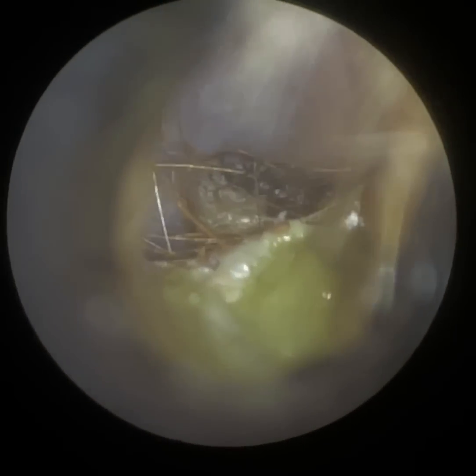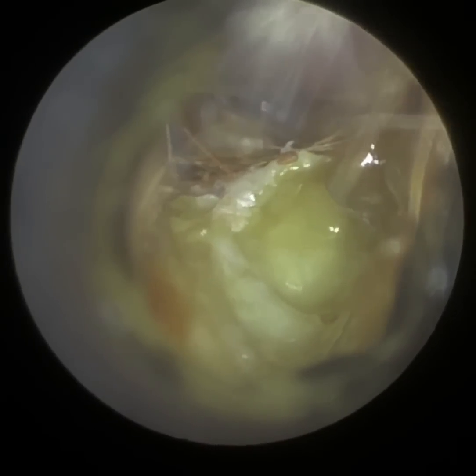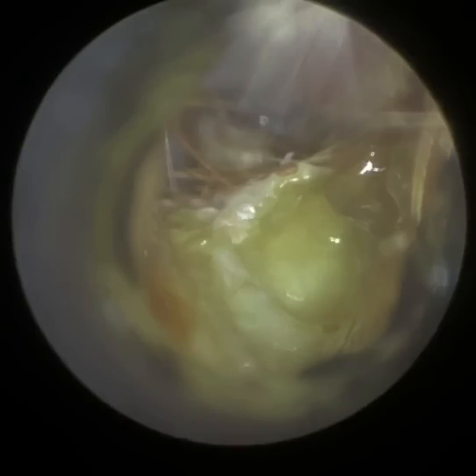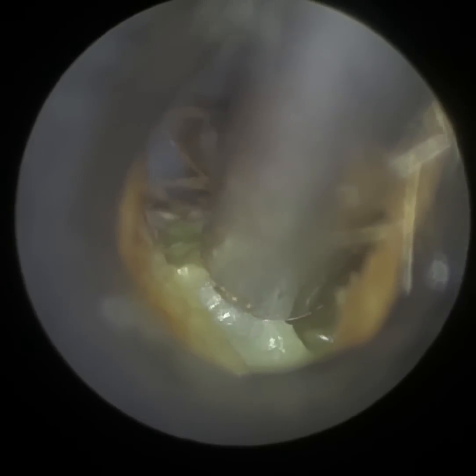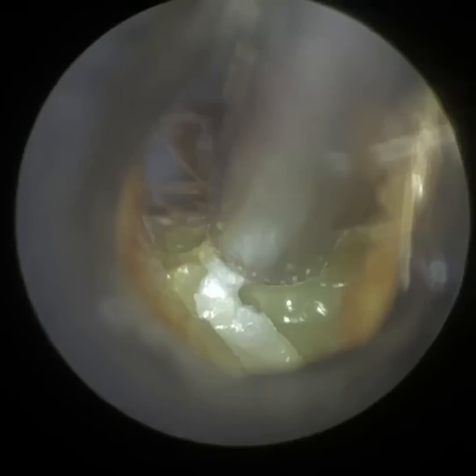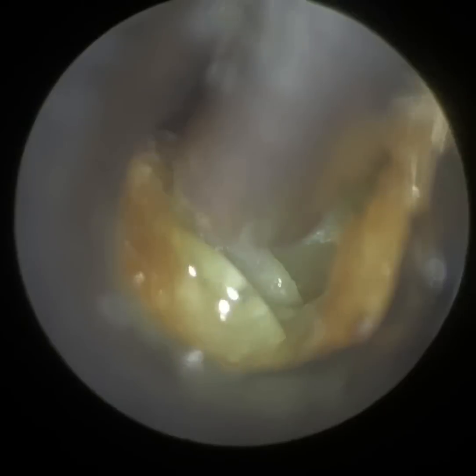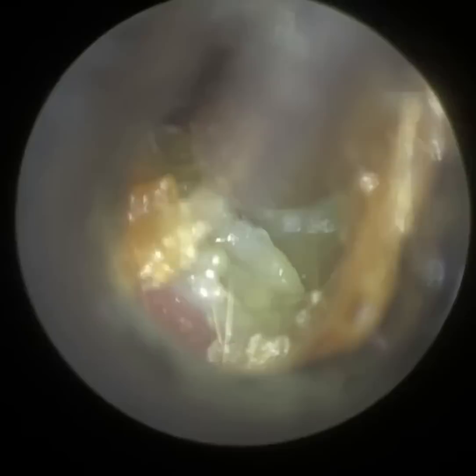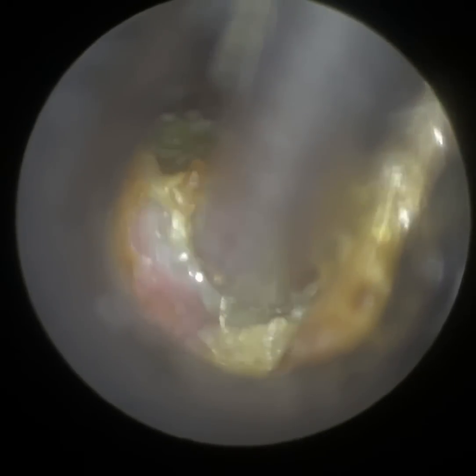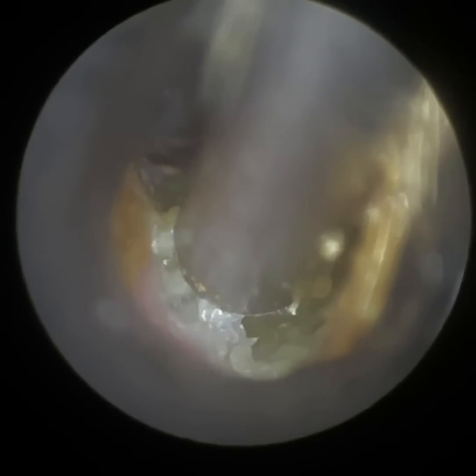The eardrum is visible. I'm just focusing on this discharge. There's a bit of wax in the distance as well, which we will remove. I want to see what's underneath — it could just be a layer of dead skin that's likely infected, and underneath that it's all healthy. But we don't know, and it's really important that if possible we try to remove this. Underneath the discharge, you can start seeing a thick layer of epithelial skin.